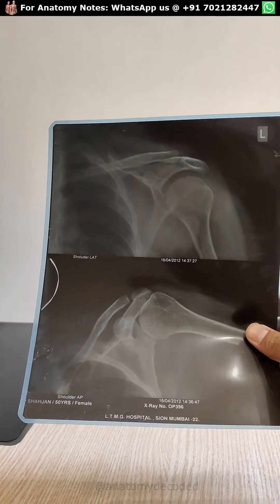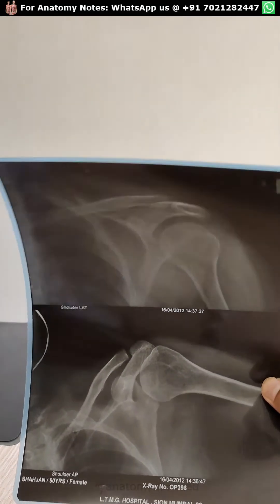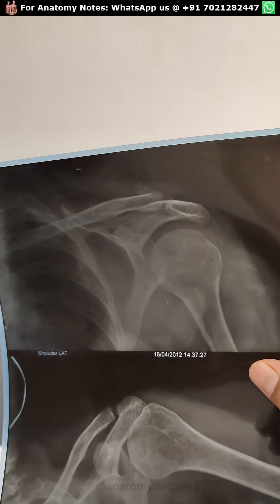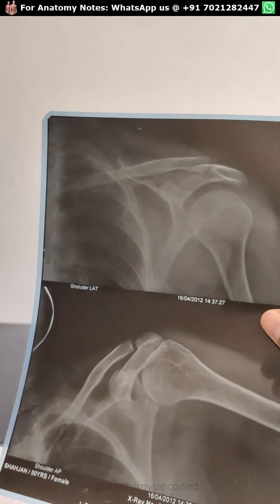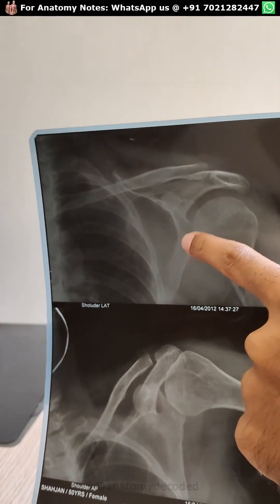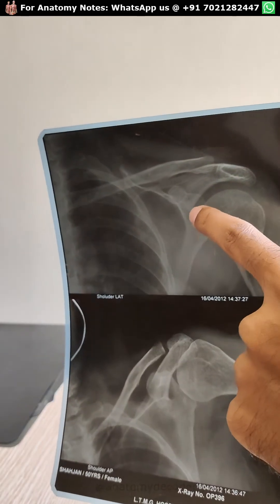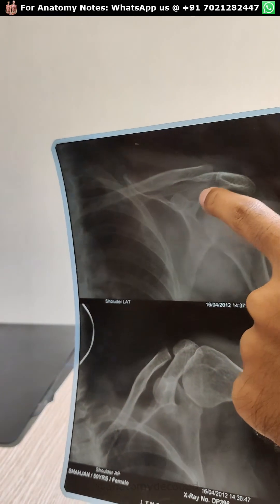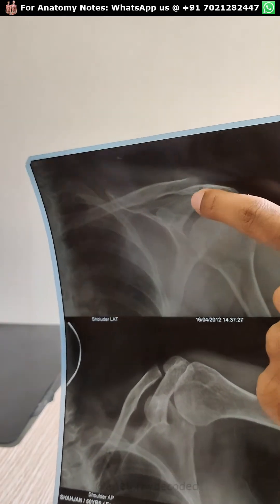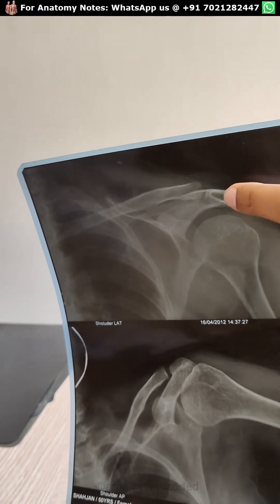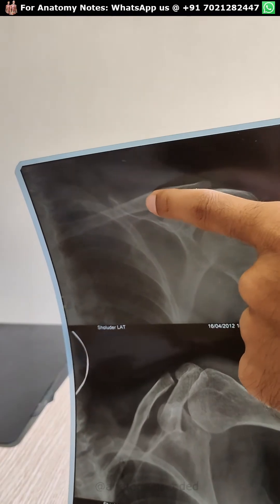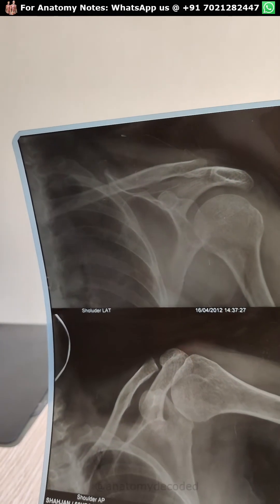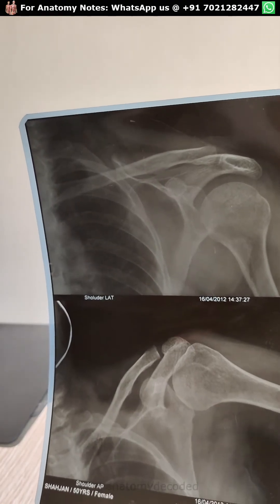This second skiagram is also showing the left-sided shoulder region. Focusing on the upper part, we can see the same structures: the shoulder joint with the head of the humerus, the glenoid cavity, the coracoid process. The acromion process is clearly seen here — it was not very clear in the previous x-ray. This is the acromion process, and this is the clavicle. The shadows of the ribs and the left lung are also seen here.